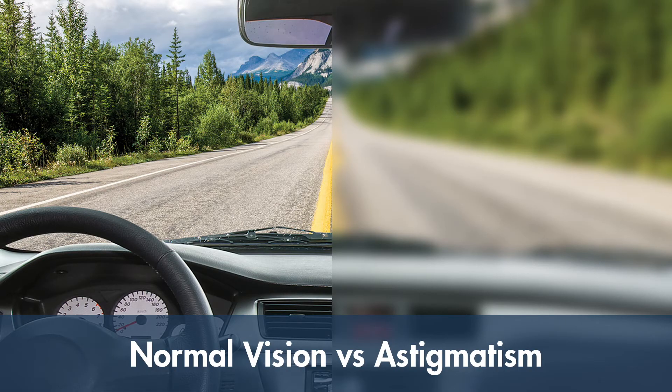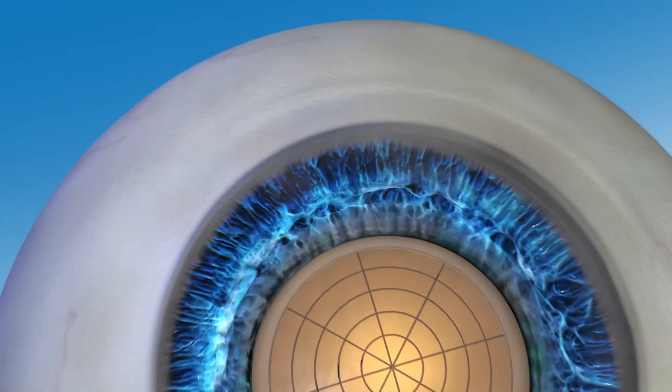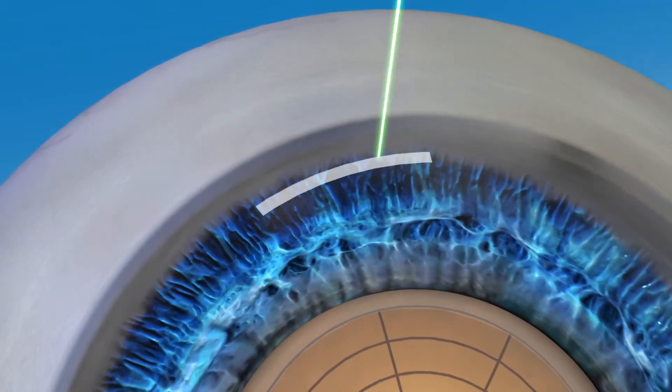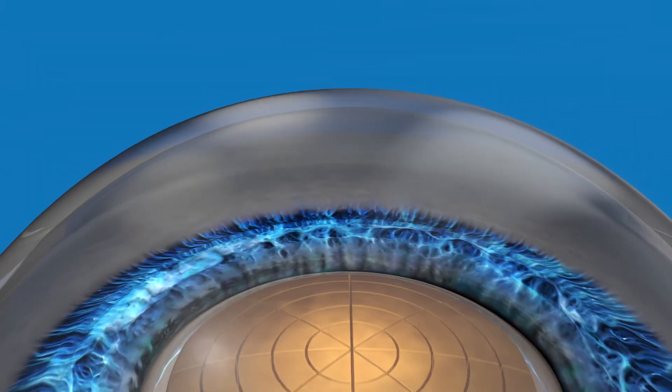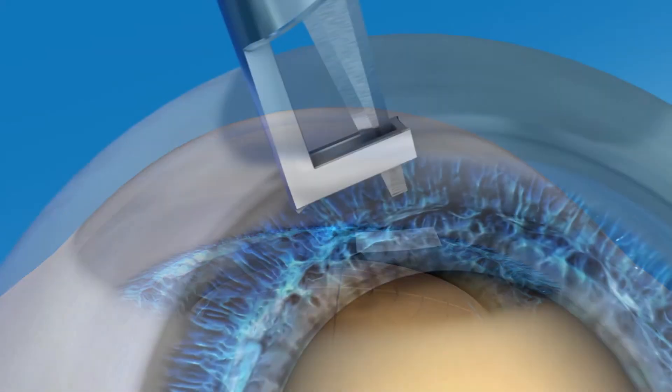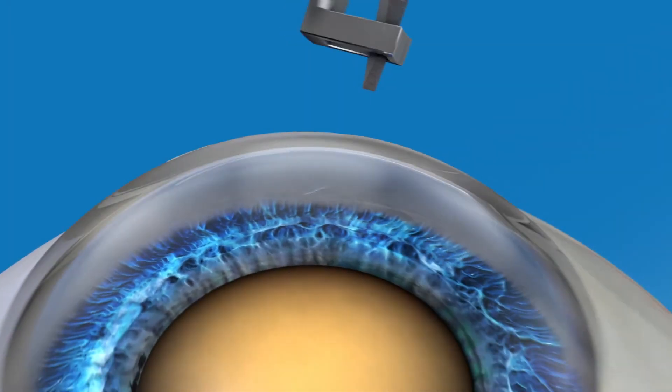Your surgeon can now use the LensR laser to help guide treatment of your astigmatism during your cataract surgery, thanks to the advanced features of the laser system. Depending on the amount of astigmatism you have, your surgeon may use the laser to create small incisions on your eye to reshape it. These incisions can be made more precisely with a laser compared to manually making them with a blade.